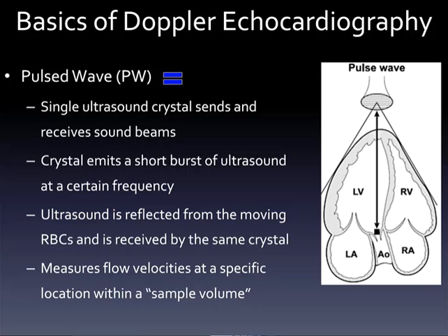And on the GE machines, which is what we have at the institution, that's going to be an equal sign. So whenever you're playing around with Doppler, just make sure if you're using pulse wave, it's with the understanding that you're getting a sample volume at a specific location only.